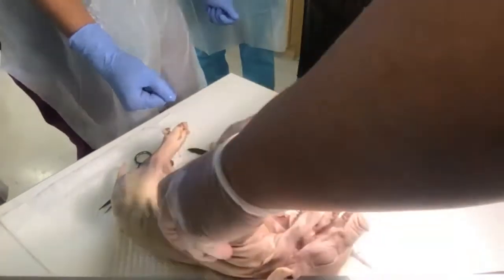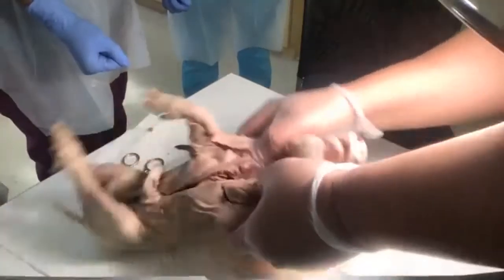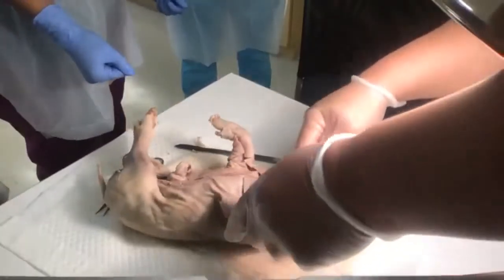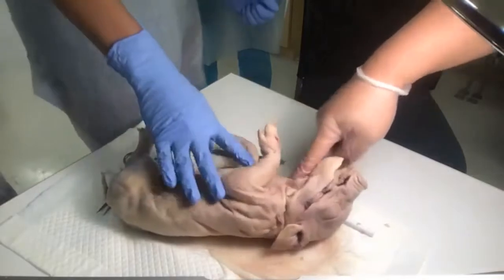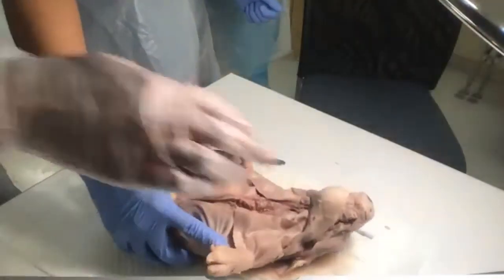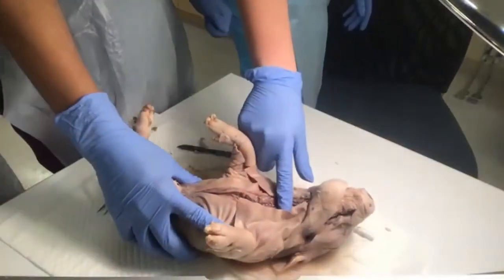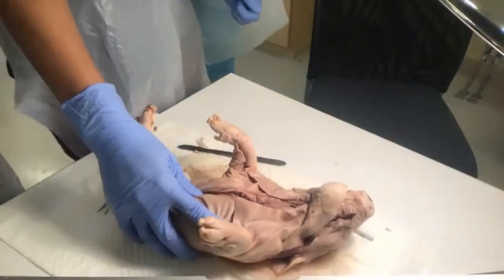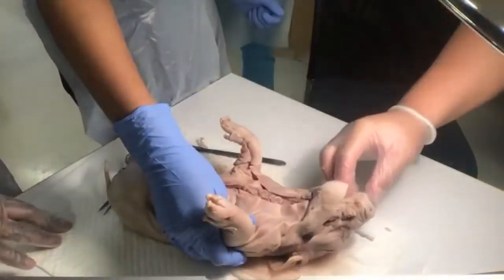So have whoever's going to be the next holder or assistant hold this down here, and then the surgeon, open all of this, and you can see fascia. Oops, I'm blocking it. You can see all the fascia here. Open all this, because this is your larynx, okay? Before we all cut it open, everyone feel it, how hard it is, because it's what? If you recall the lecture, the larynx is cartilage. It's not quite bone, so feel that, and then feel the teeth.